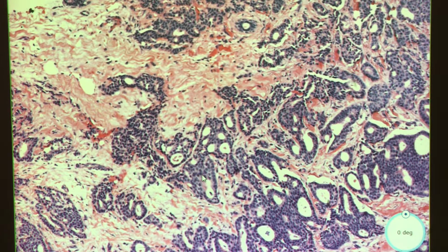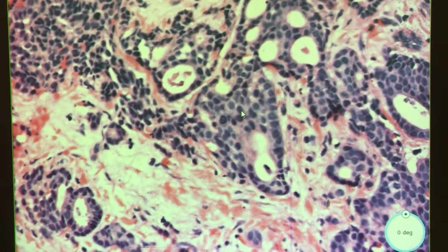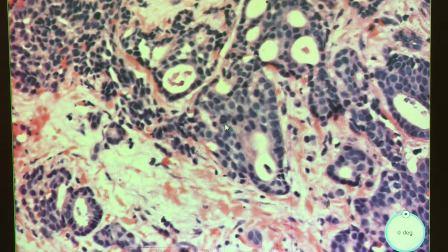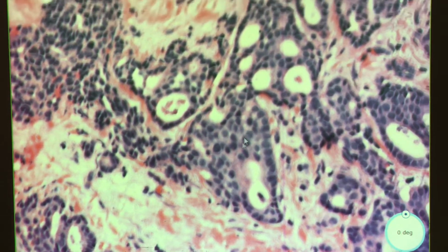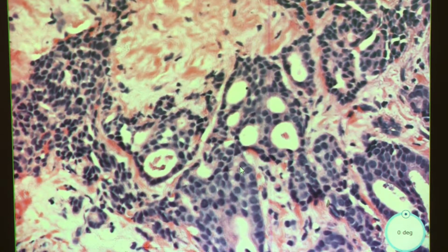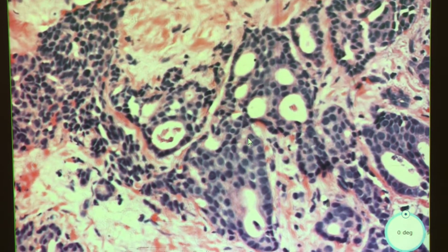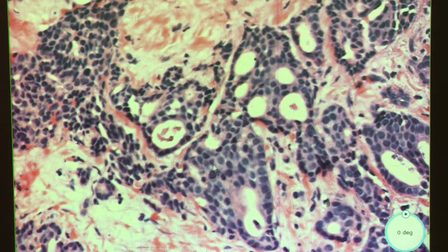Relatively monotonous cells with maybe some slight anisonucleosis where the nuclei aren't quite the same size, not quite the same shape. So still low grade. I'd probably give this a 2 for nuclei. And in the handouts for breast, I did put in more information about grading and stuff, and I believe I have information about grading in this presentation too.